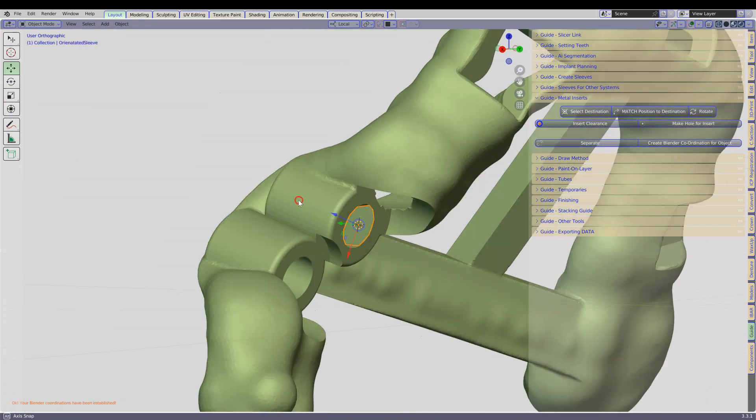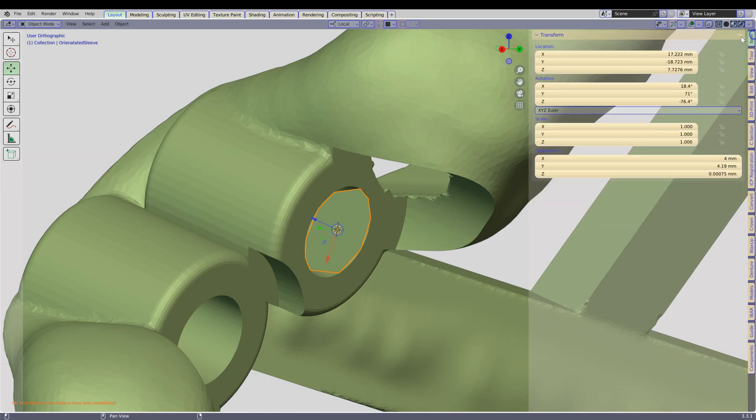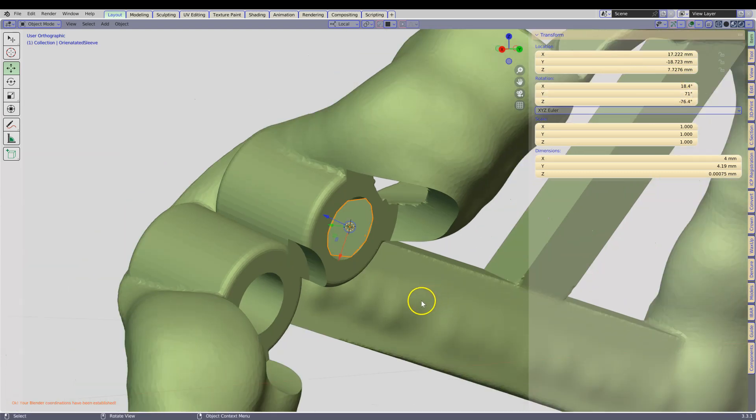You will now notice that there is the widget. The arrows are going in the correct direction, and we have a coordination. Locations have been set up and rotations have been set up.